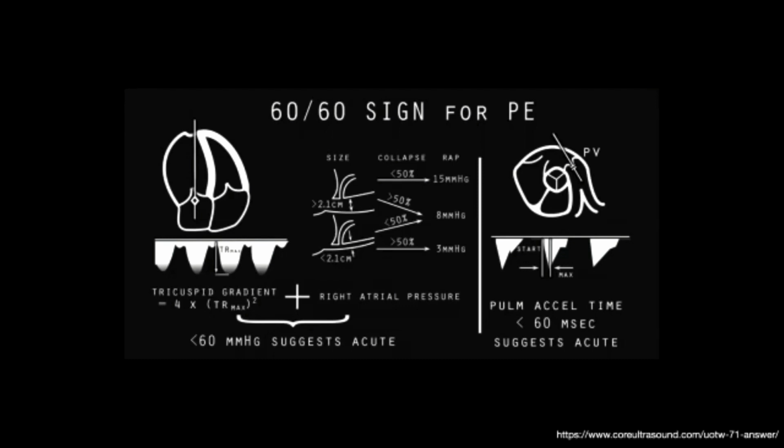Despite all of that, the correlation between PA pressures measured by invasive left heart and right heart catheterization and by echo is off about 30-40% of the time. So even in the best of hands, you may not find the best correlation. There's both underestimation and overestimation. Some of it is explained by the fact that you're not doing those measurements simultaneously. If you're doing an echo today and the cath tomorrow, and the patient's lying flat and sedated during the cath or ventilated, a lot of different things can occur between when the echo was done and when the invasive right heart catheterization was done, and that could explain some of those differences. But many times it's because echo is not able to pick up the TR gradient properly. Hopefully that answers that question.